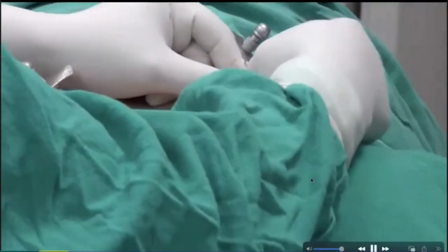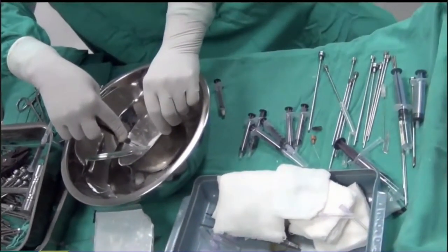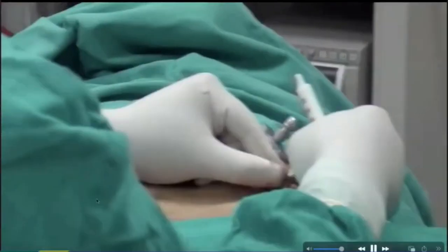I'm putting cement in the other one now. And this cement was, actually, I allow it to regurgitate. So if I'm not happy with the cement positioning, I allow it to come out, or I might aspirate sometimes if you think it is going to the wrong place. But you are very, very careful. But anyway, keep the needle track clear.